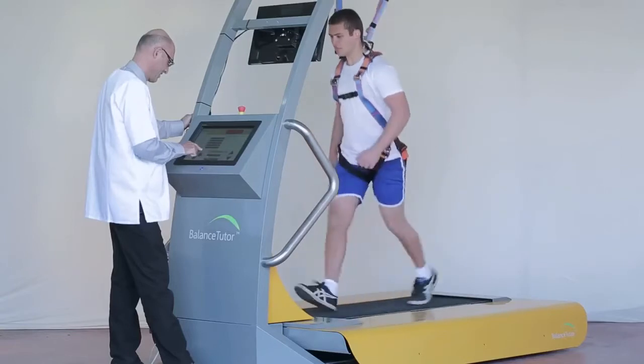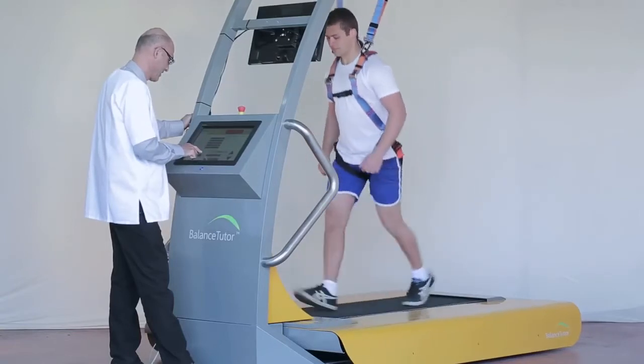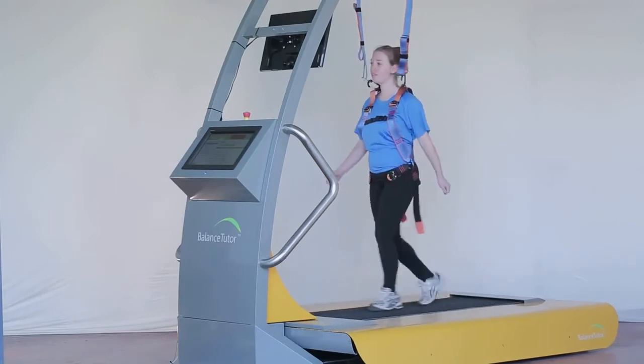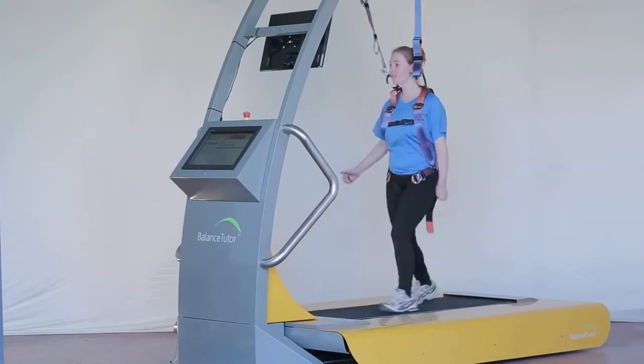The Balance Tutor significantly improves balance and prevents falls, allowing for improved quality of life.